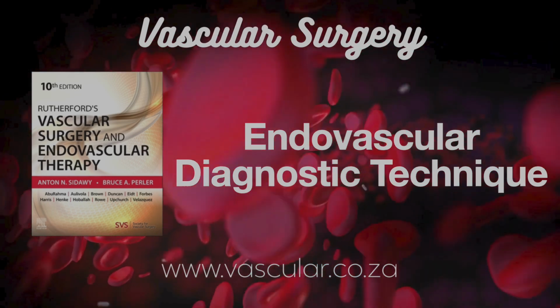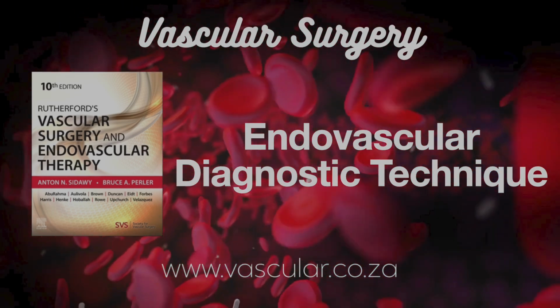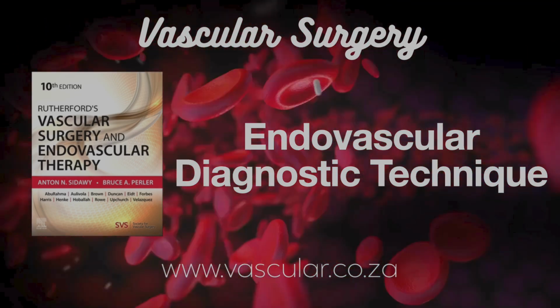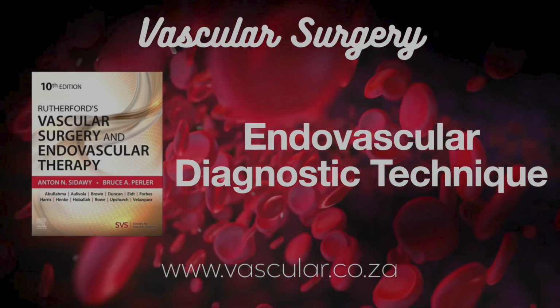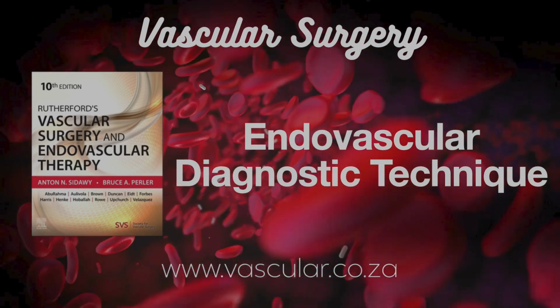Okay, access maintained. Now the diagnostic catheters themselves, delivering contrast. That's their main job, yeah. Delivering contrast dye right where you need it for the angiogram pictures. And like wires, huge variety in size, length, tip shape. What features do they have? Often radiopaque markers, maybe hydrophilic coatings for slipperiness, sometimes braided walls for better torque control, the ability to twist and steer.